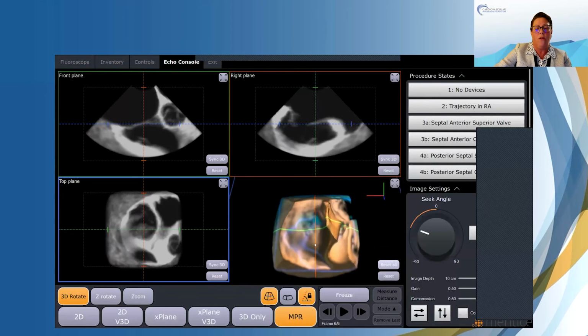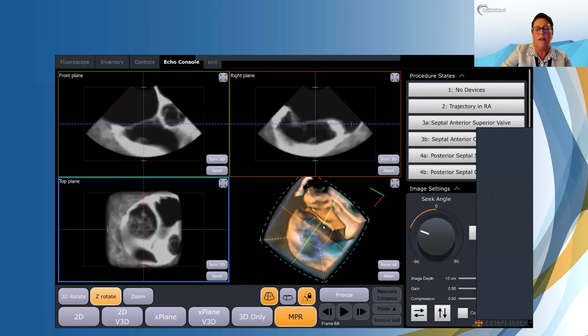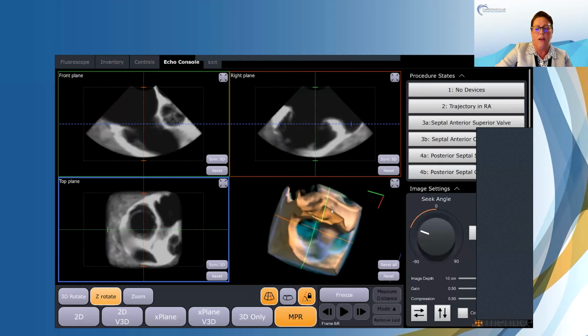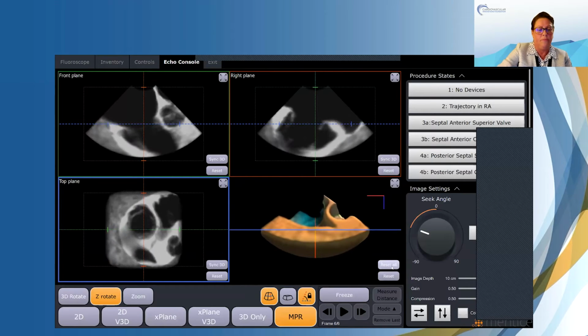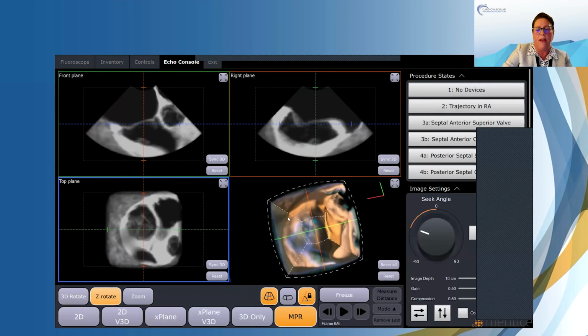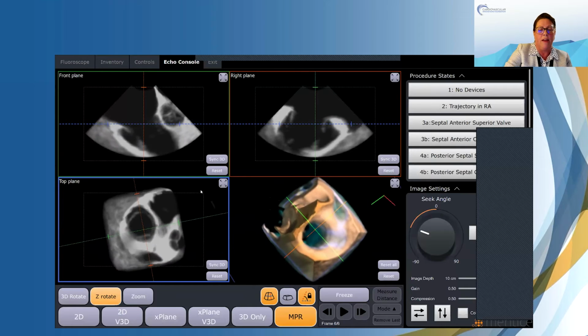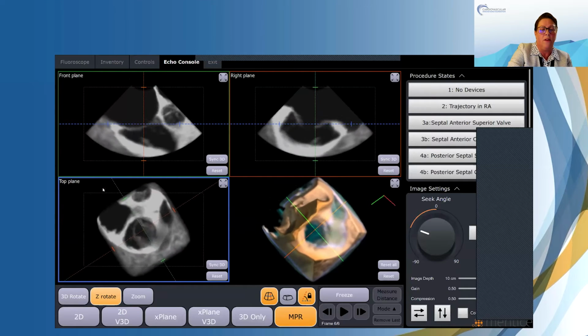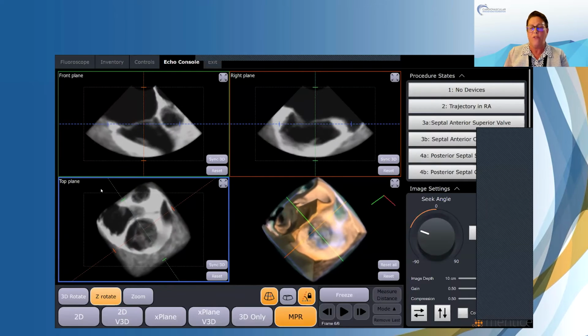So now, again, I'm going to put my aorta up here at 11 o'clock. And I'll move this one as well. So now I have those two optimal views, -45 and +45, both fall in the good zone.